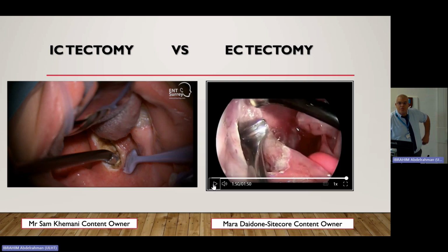Because usually when you use the coblator for adults, in my personal experience, it's very hard to take it out. You know what I mean? They have a lot of tonsillar scarring tissue, a lot of stones inside. Sometimes it's very difficult to reach that. And you leave a remnant, and those people will come back and back with bleeding, infection, sore throats.